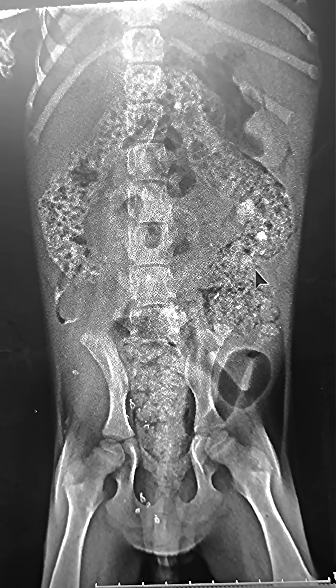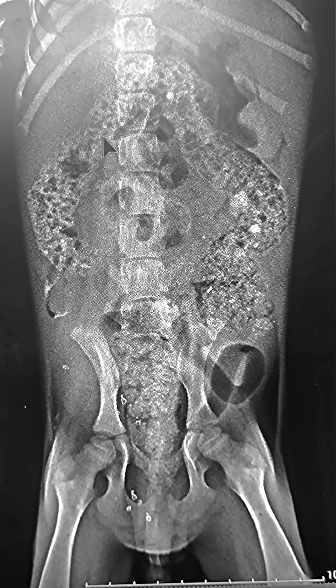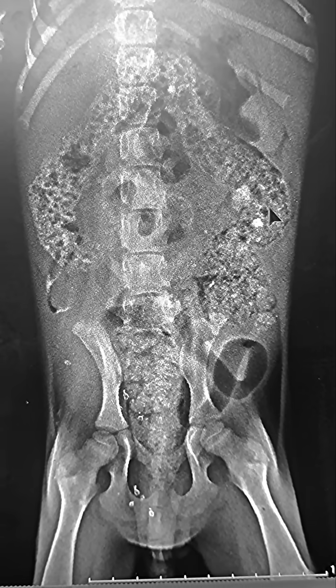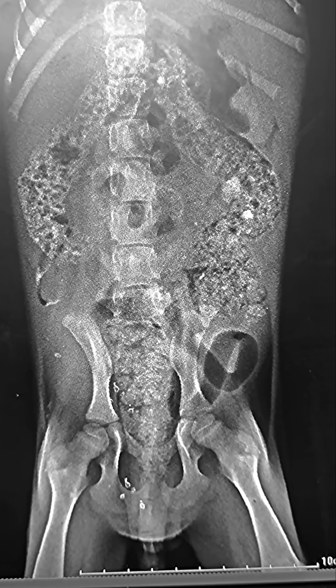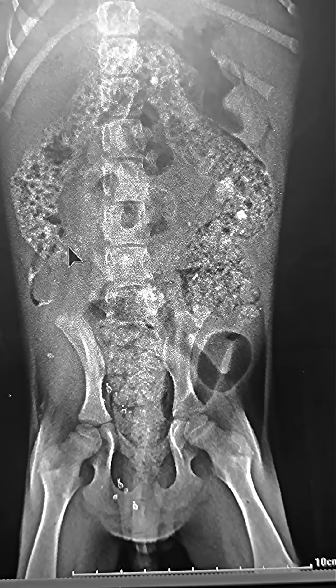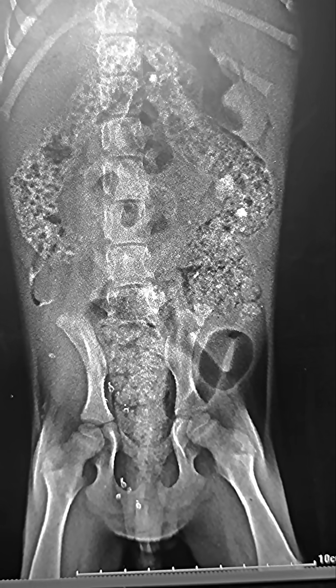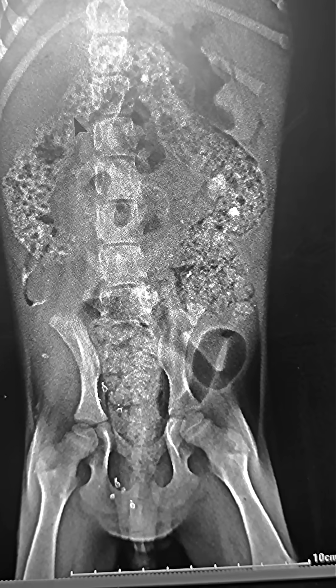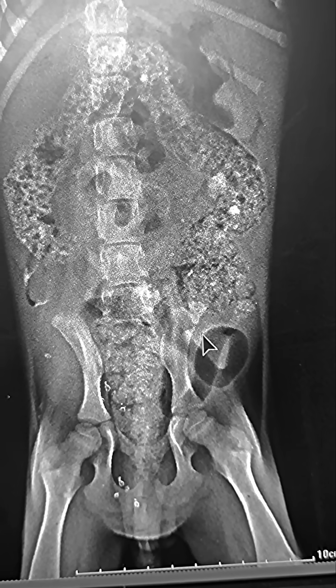This is a ventro-dorsal radiograph of a two-month-old puppy. You can see there is an increased radio density in the colon. This is basically an obstipated colon, and this is because the puppy is probably suffering from mineral deficiency — calcium and phosphorus. This type of finding is seen in cases of pica.